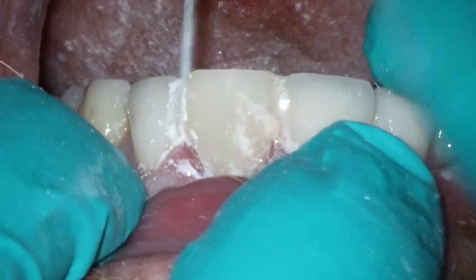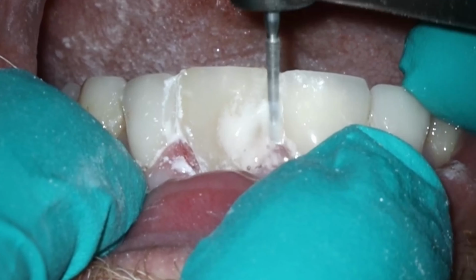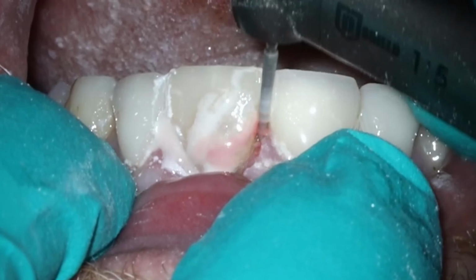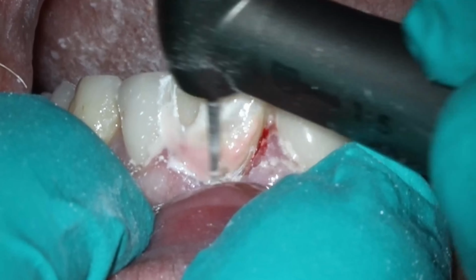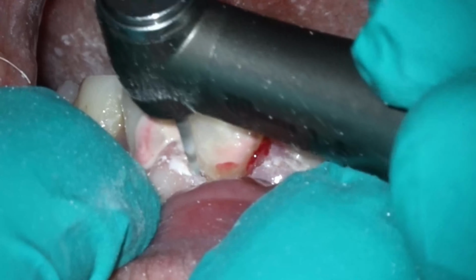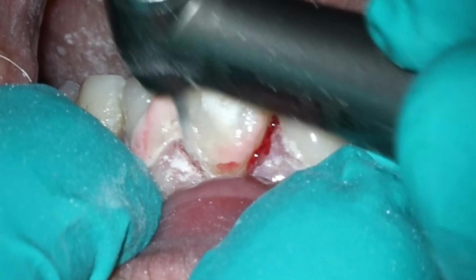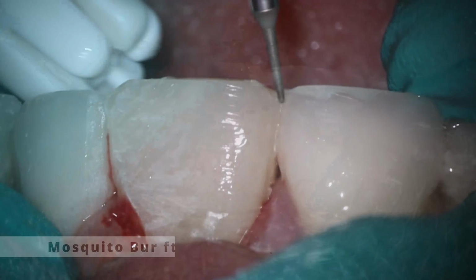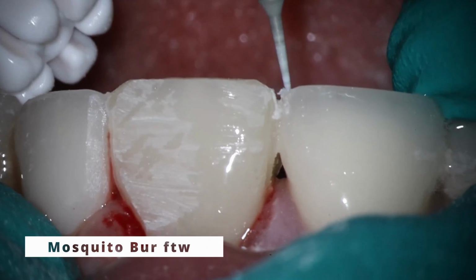What we can see here is I'm just adapting those line angles a little bit better. I found that the skinny diamond is a lot better for this, and so that's what I'm doing, just polishing along there. A little bit of gingival irritation, but that was that spot you saw me earlier zap with the alpha unit, because there's a little bit of gingival overgrowth. That's why we have a little bit of bleeding there, but by the time we're done, it looks good.